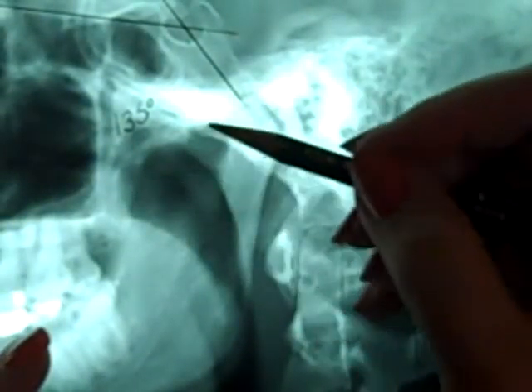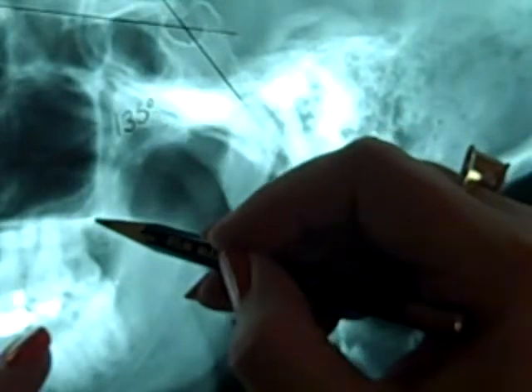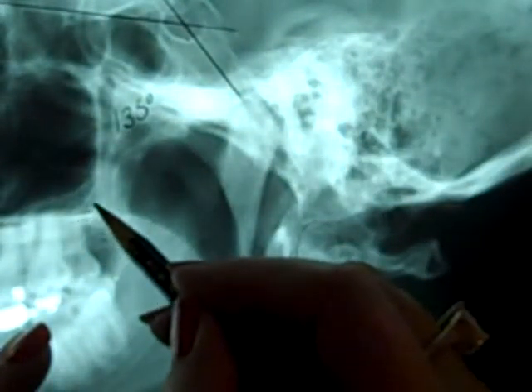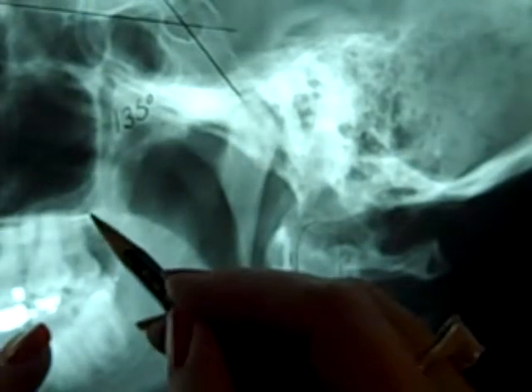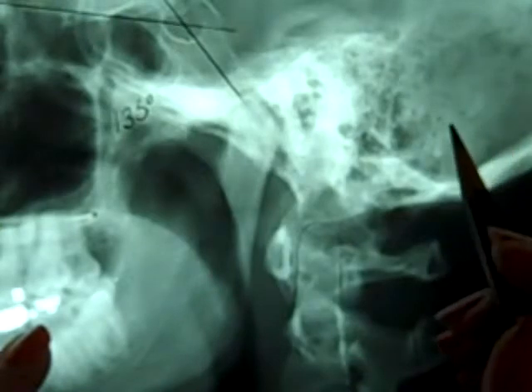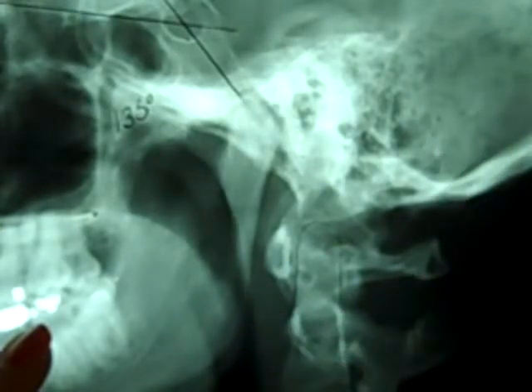Chamberlain's uses the posterior aspect of the hard palate. Again, that's this structure right here, not the superior aspect, just the posterior aspect. You see how close that would be as far as what it would appear to be on a film. It also uses the posterior aspect of the foramen magnum.